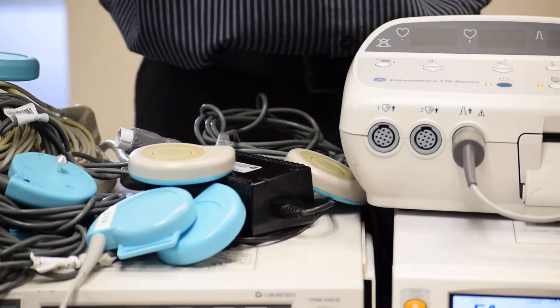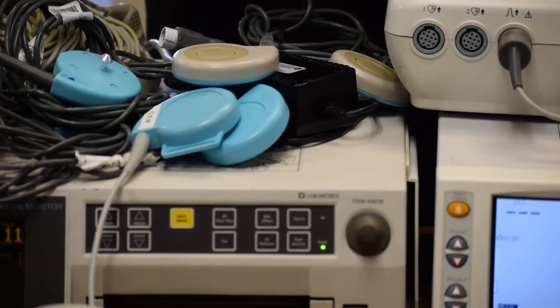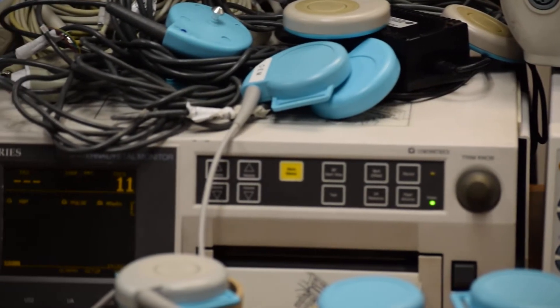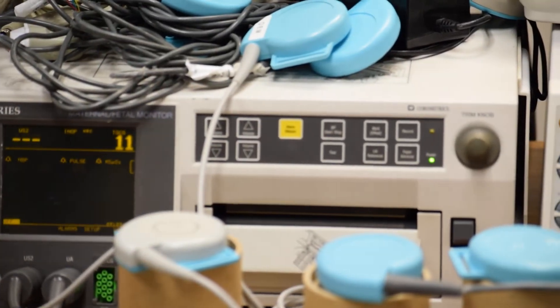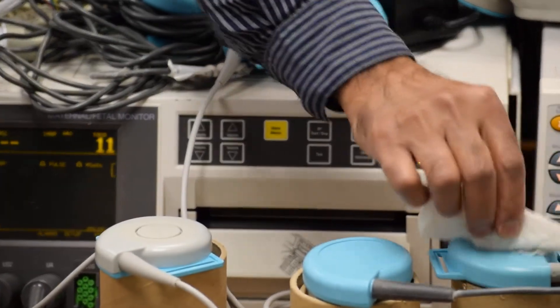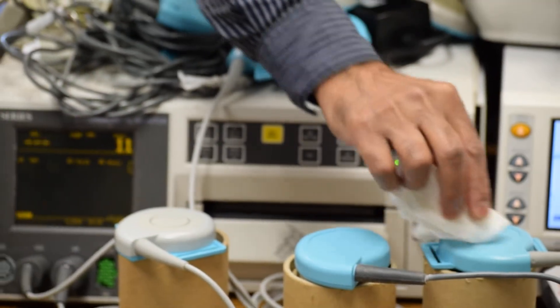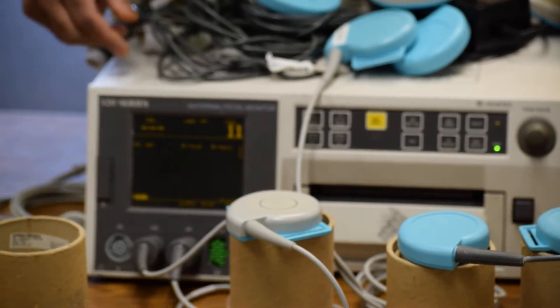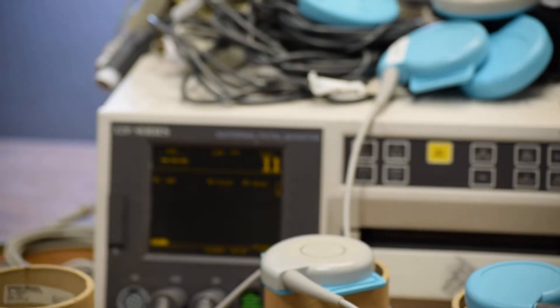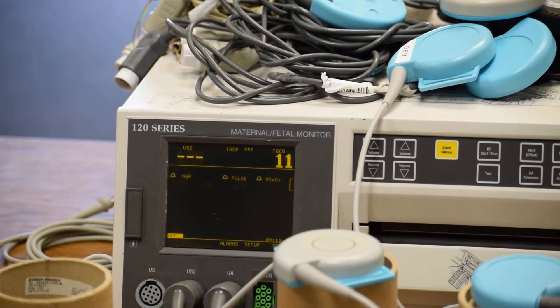We have transferred the OEM transducer from the 170 series monitor to a 120 series monitor to check whether it is working. It is perfectly working fine. You can see the display — three dashes, it is stable, there is no spurious pickup at all.